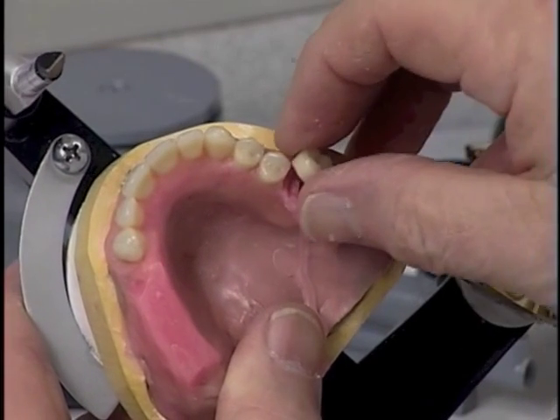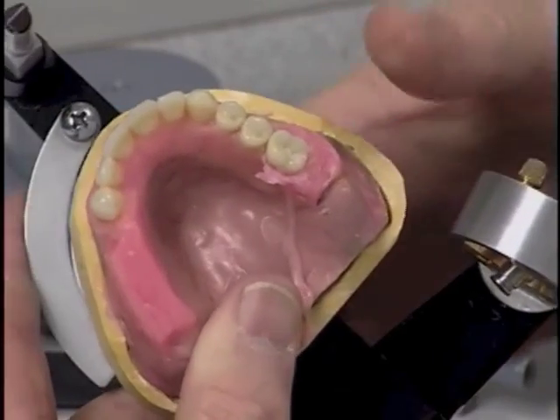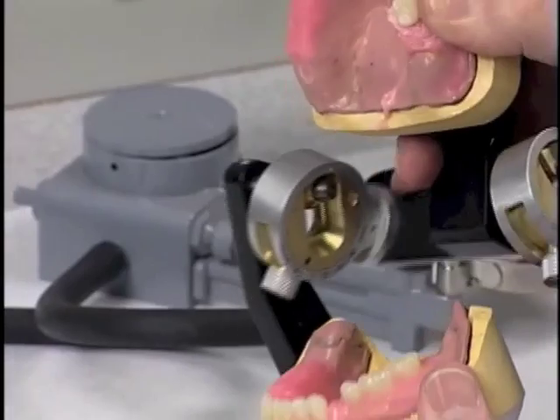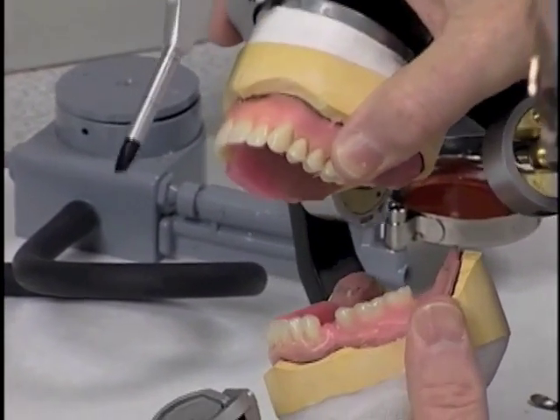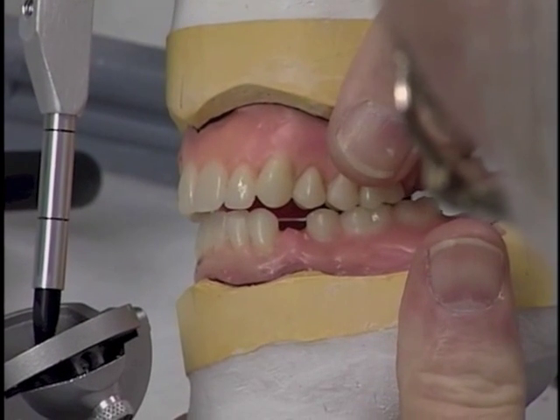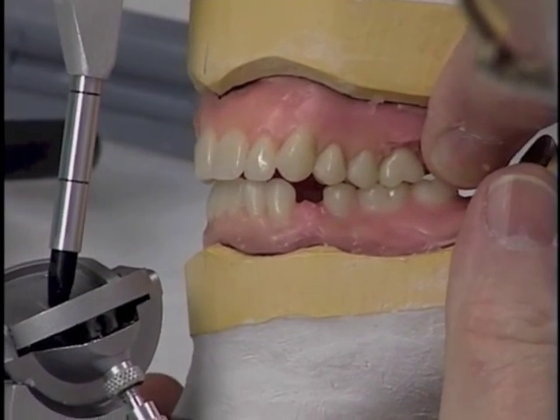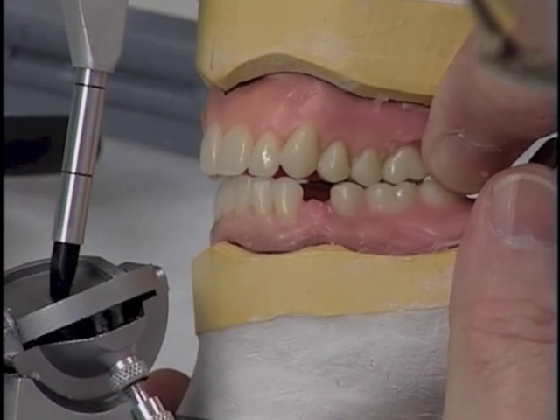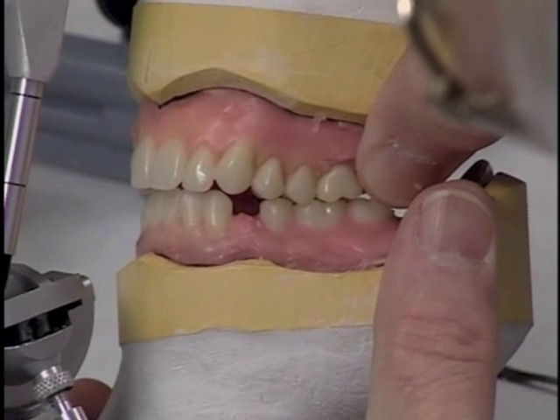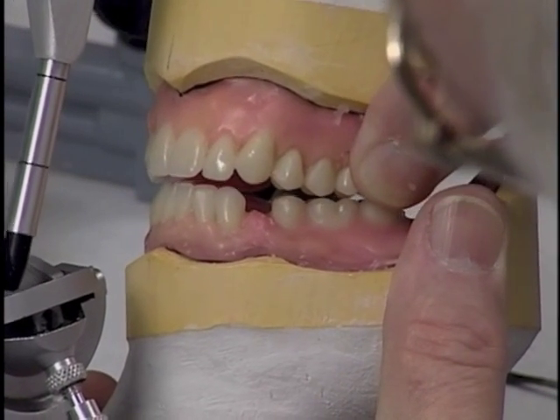And hopefully we have enough room and don't have to end up having to grind on the tooth, but let's see. Now as we close it, we want to make sure it's in centric relation, and we're going to close the articulator and mash it into place in centric relation. Then we're going to move it over into working relation, mash it into place, back in centric relation again, and then over into non-working or balancing relation.